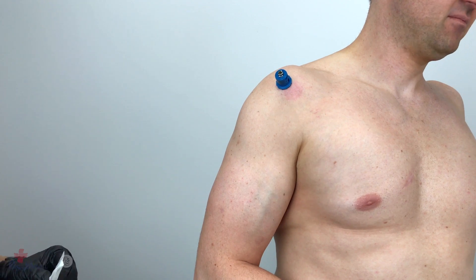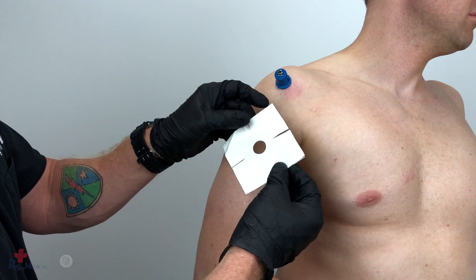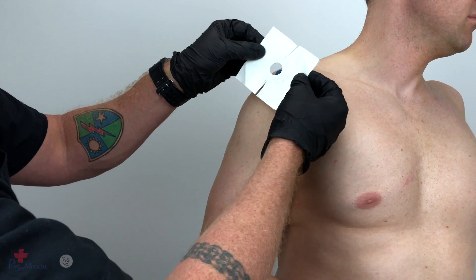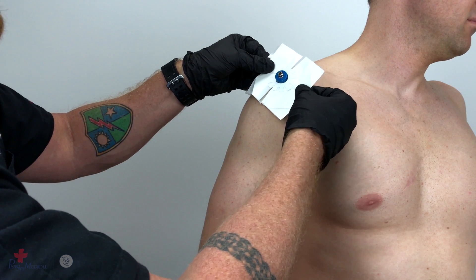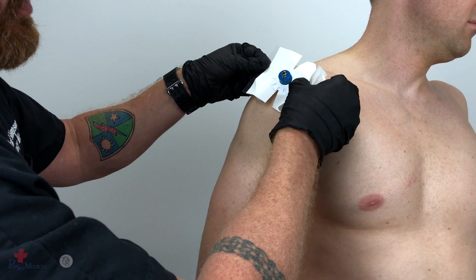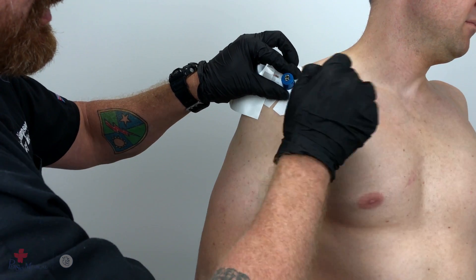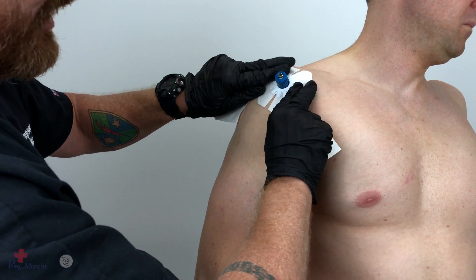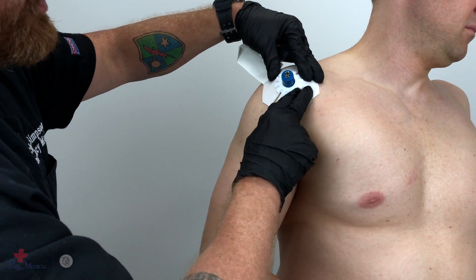Once patency has been established, take the neofixation adhesive and place the center punched portion over the stabilizer base. Apply equal pressure to the adhesive covers on the underside pulling away, and apply the adhesive stabilizer evenly.